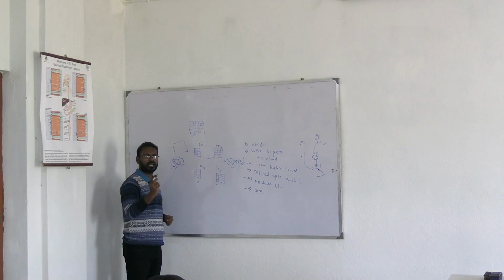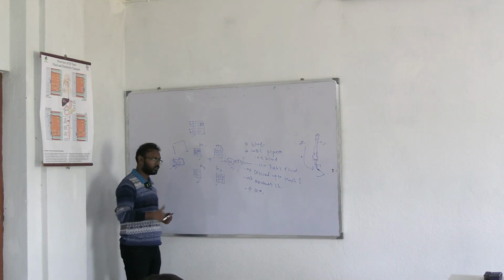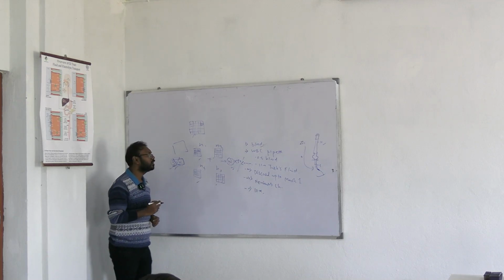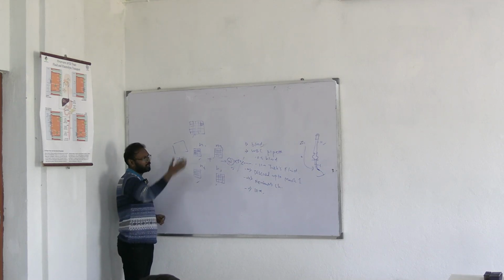The Neubauer Chamber is the apparatus by which you actually calculate the WBC or RBC, but in case of hemoglobin you have your hemoglobinometer. That was the hemoglobinometer, what was the name, Sahli's hemoglobinometer. Okay, so today we will be just recapitulating.